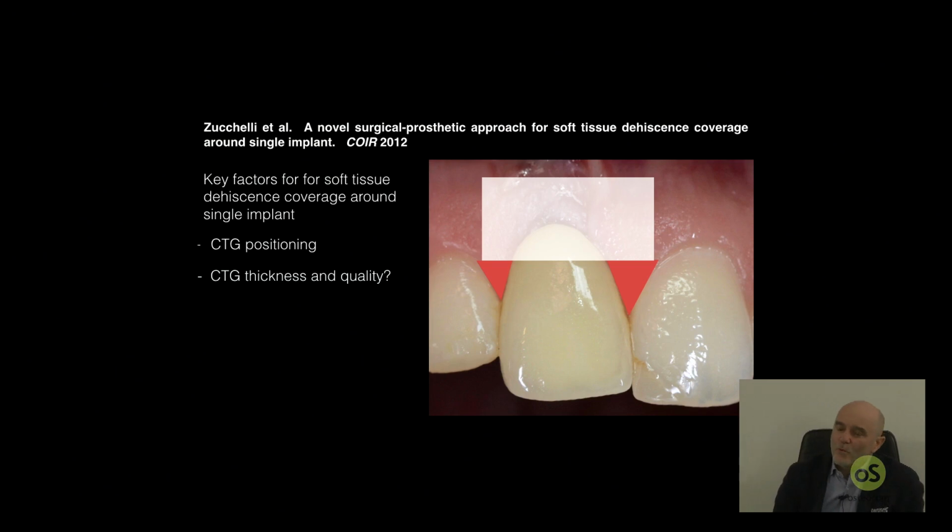And what is this papilla area? I have to consider that this papilla is the blood supply for the flap. And so if I want blood supply coming from the papilla, I have to remove the epithelium from the papilla. So I have to consider this papilla once it is deepithelialized. And so now you have to think about this papilla with a triangular shape, very, very acute tip. Once they have been deepithelialized, how much connective tissue bed do you leave there?